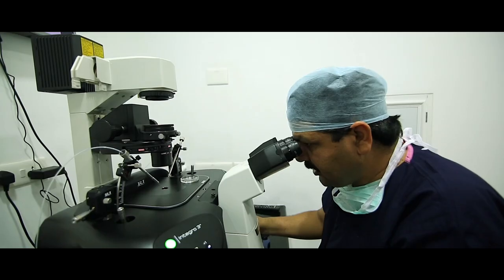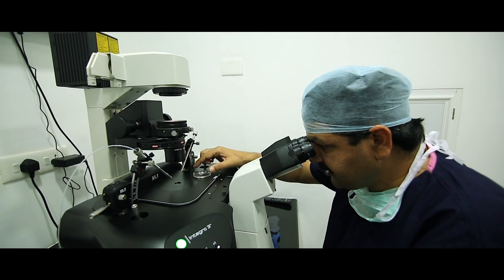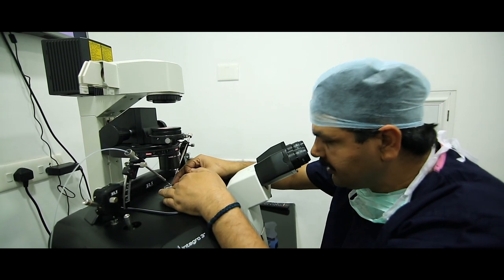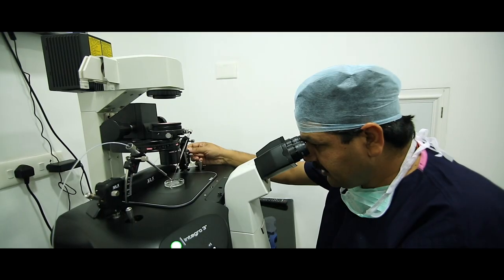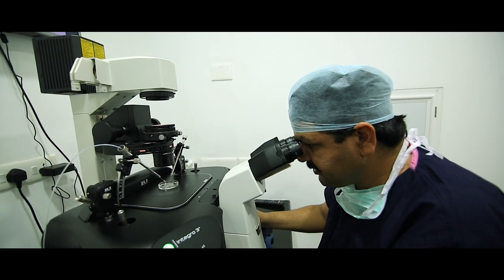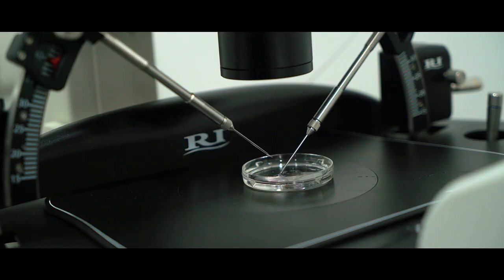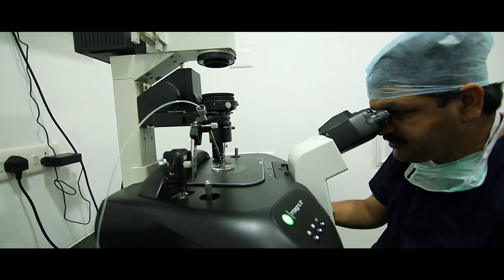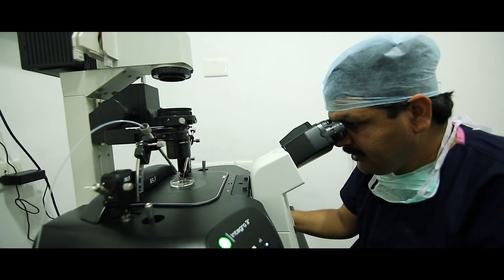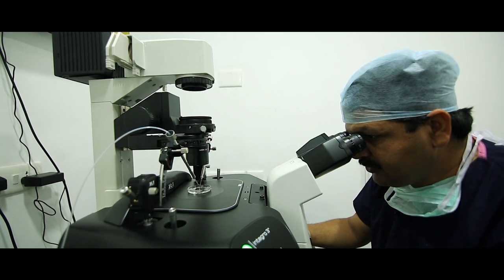I move the holding and injection pipette up slightly, and I am loading the oocyte and sperm first. I focus on the empty PVP drop and lower the injection pipette. You can see this needle is aligned properly. Remove the air bubble and take in a little bit of PVP. The next step is to move the injection pipette towards the spermatozoa drop and immobilize the spermatozoa very easily.